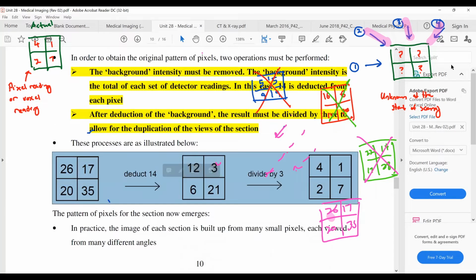Okay, when you do the scanning, it's usually only in 4 directions. You may be asking, why is it that we don't scan here, here, here, and here? Now, if you scan here, it's actually just a repetition of what you're scanning here because they are symmetrical, you see. Whatever you're scanning here will actually be the same as what you're scanning here. So there's actually no need for you to repeat your scanning here.